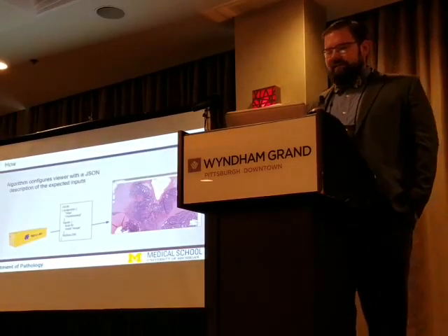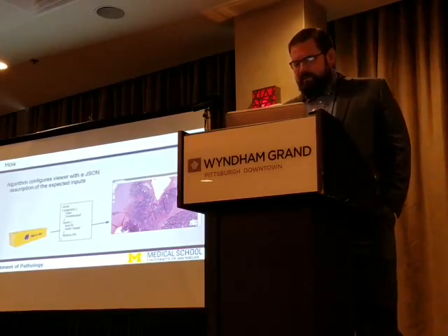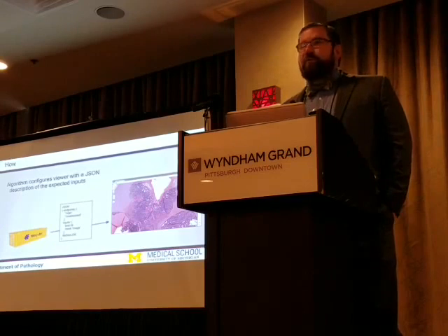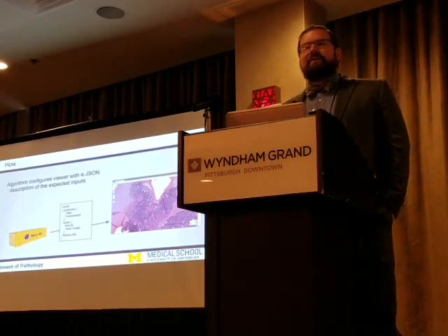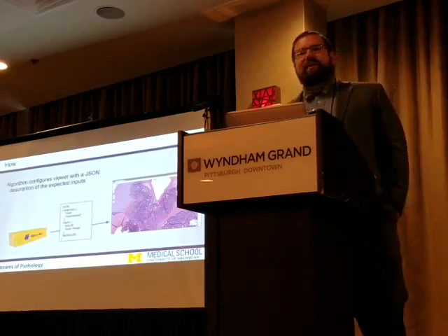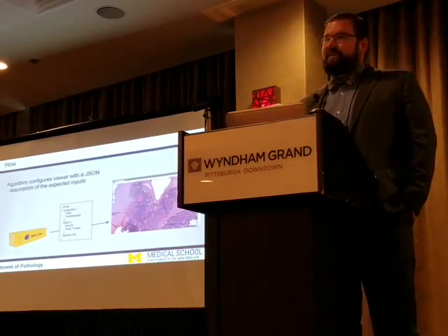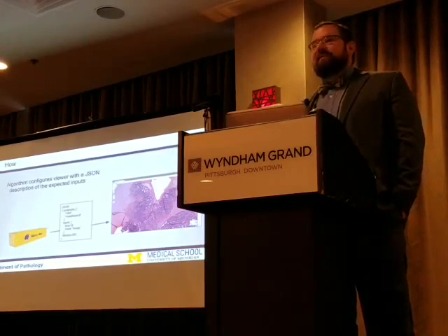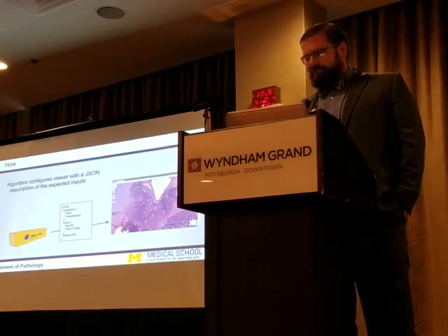So the workflow would be, when the viewer loads the algorithm, there's probably going to be some type of configuration step where the algorithm has to communicate what endpoints it supports, if there's any user provided parameters, what the expected tile size is, and such.